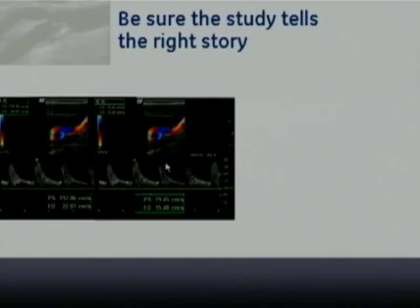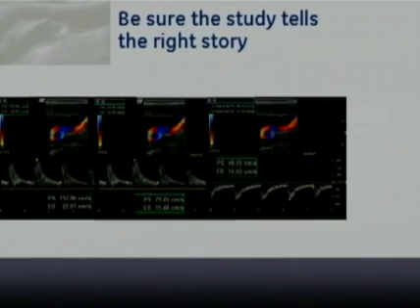And when I lift off the probe or update the image, I could see that I had moved slightly. I adjust the Doppler angle very carefully for the area that I'm in within this coil, and I have a good velocity. So it was really closer to 79 or 80 centimeters per second in this area, not 112.